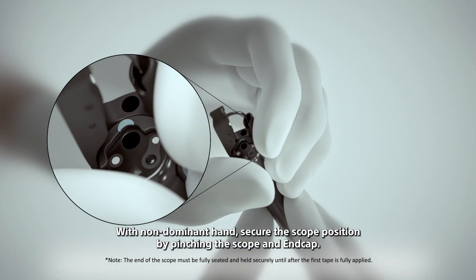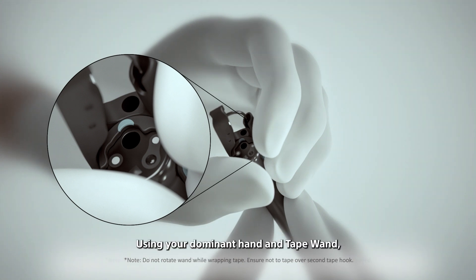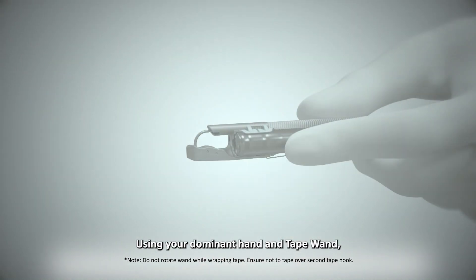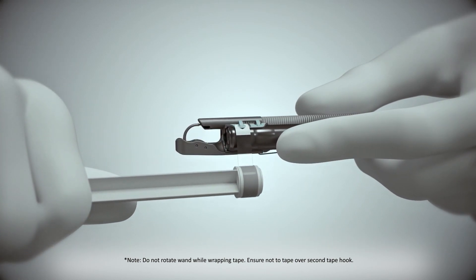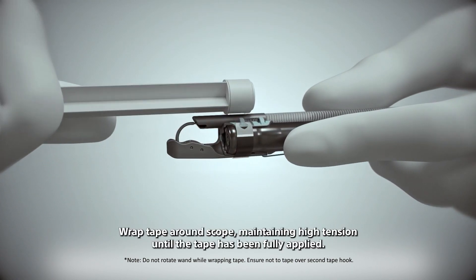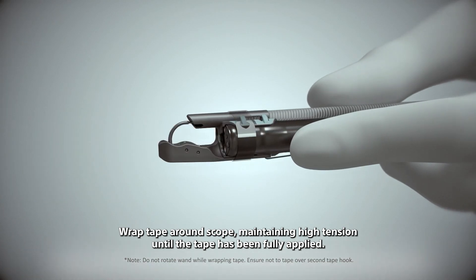With non-dominant hand, secure the scope position by pinching the scope and end cap. Using your dominant hand and tape wand, place tape eyelet hole over distal hook of end cap adapter. Wrap tape around scope, maintaining high tension until the tape has been fully applied.